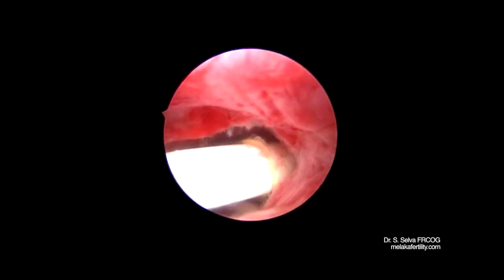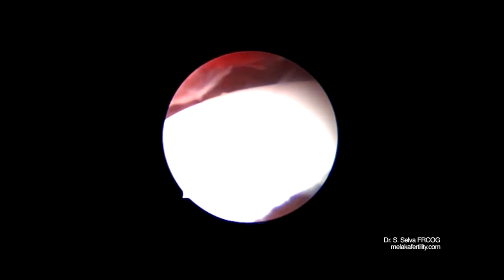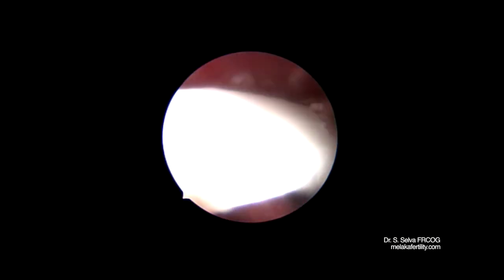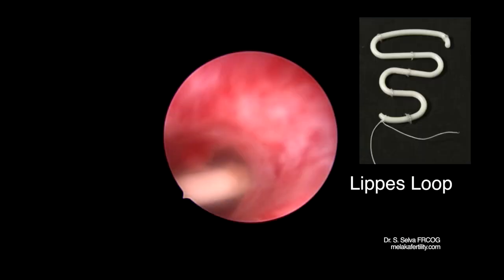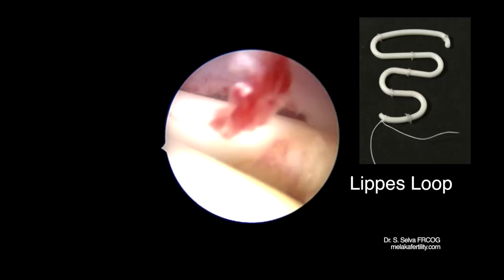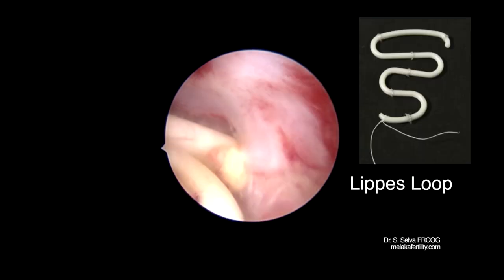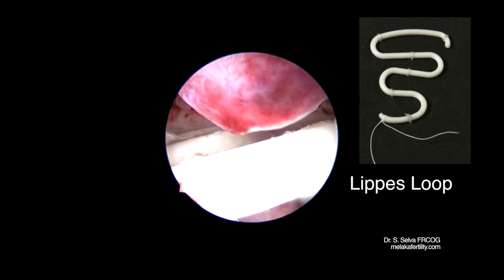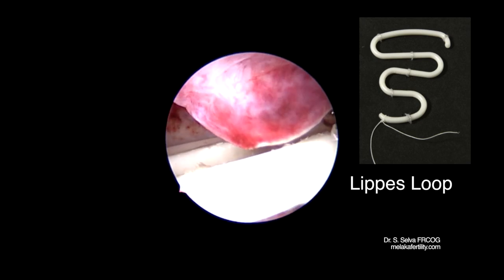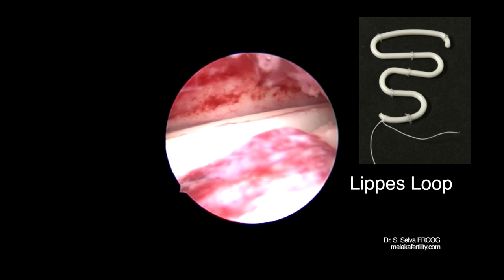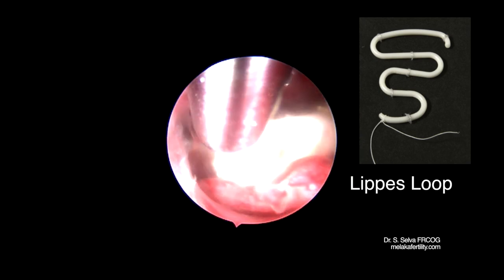This is another case of a missing intrauterine contraceptive device. This IUCD was a Lippes loop as shown in the diagram. It was held and removed with difficulty.